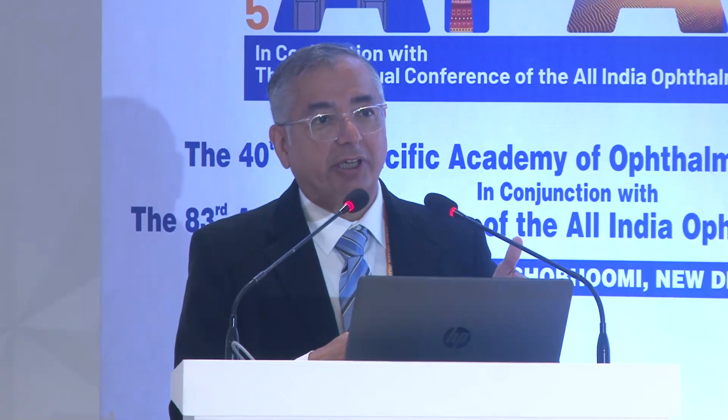Definitely, the field is the first to go in homonymous hemianopia or brain issues, where most of the time when you get the field, you're not going to get a clear-cut vertical defect. You're going to get some loss here and some loss here. Some patchy, yes. In the past, we used to have paper visual fields. We used to put them on top of each other. We have lost that ability now. So we have to imagine mentally to put them one on top of the other.